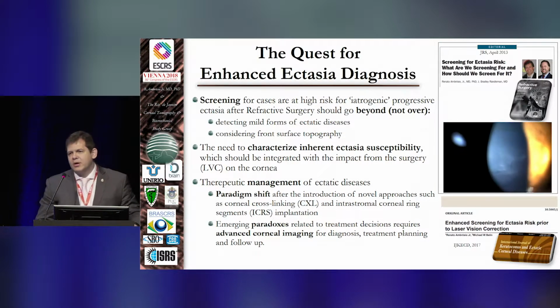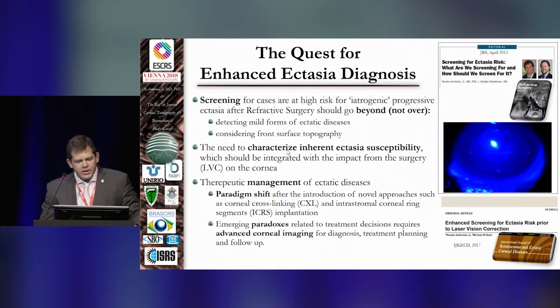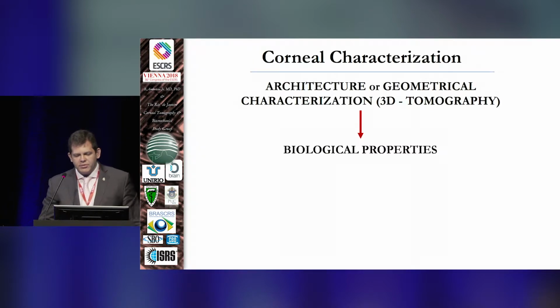So when we talk about the quest to enhance ectasia diagnosis, it's very important that we go further. We have to go beyond, but not over. We have to go beyond topography. We have to go beyond understanding of the diagnosis of mild keratoconus. We have to understand susceptibility for ectasia to develop so that we can get understanding for how to help these patients.